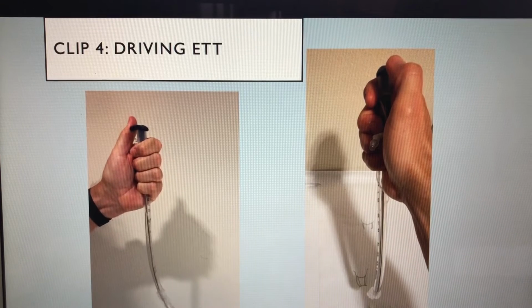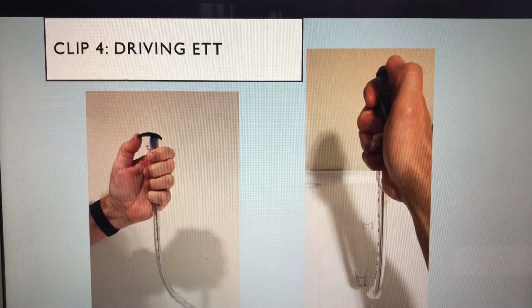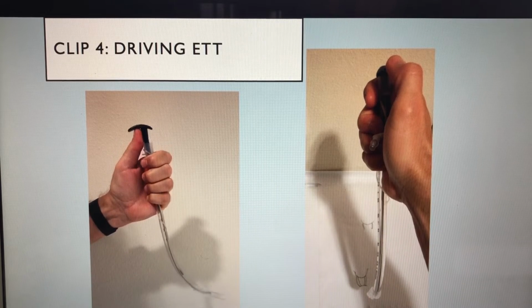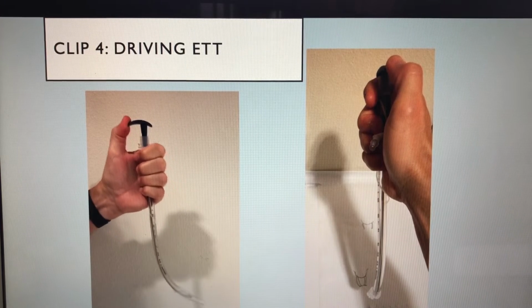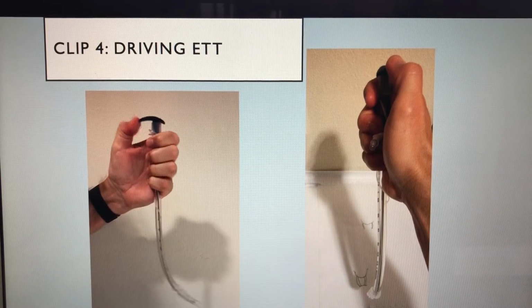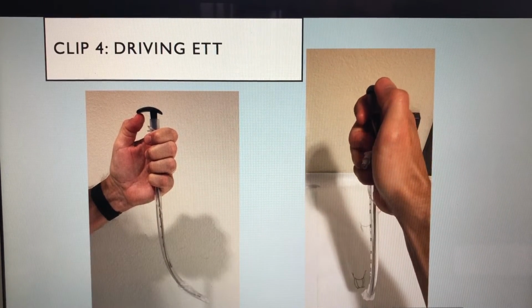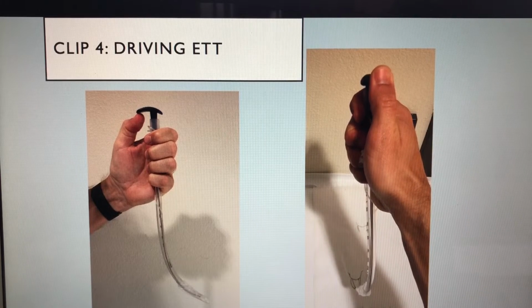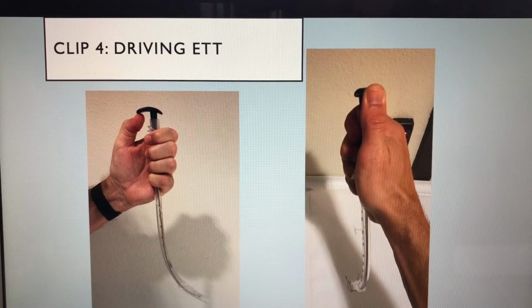As you can see, you go side to side very easily. It moves quite a bit. And then just by driving it up and down, you can see how much the tip moves up and down. There's a very simple little drawing over here. You can see how much you can move it. You can see if I happen to get below the cords, I can just push my thumb up a little bit and it'll bring the tip right into that, and then you can go through.